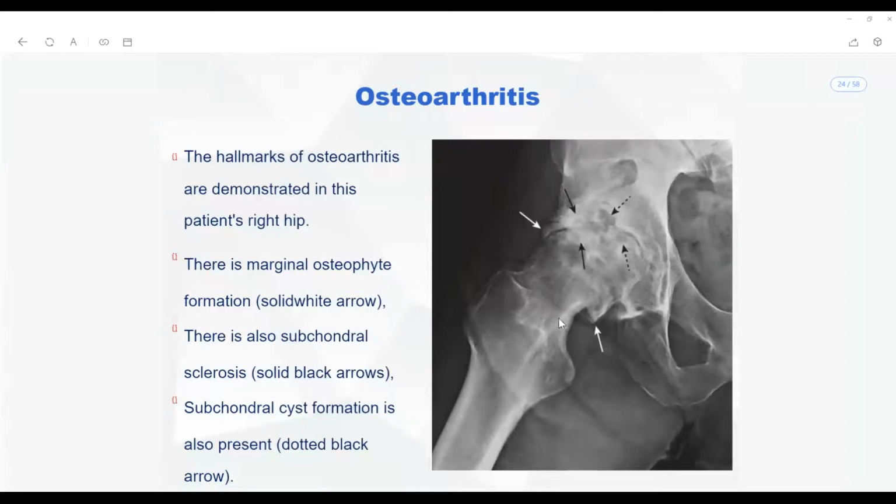There is osteophyte formation, and there is subchondral sclerosis along the superior posterior surface of the femur and along the superior acetabulum, and there is a radiolucent density along the acetabulum and complete reduction of the joint space, which suggests I am indeed looking at a case of hypertrophic osteoarthritis.